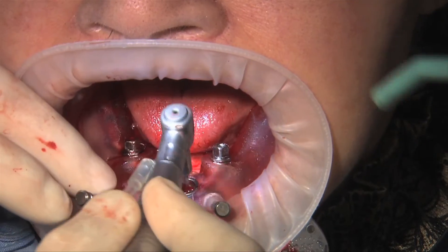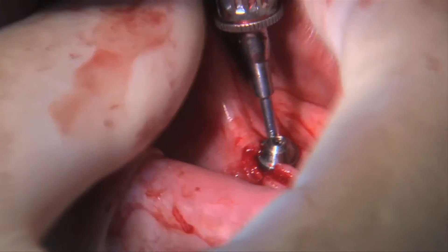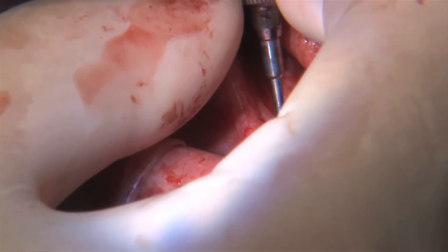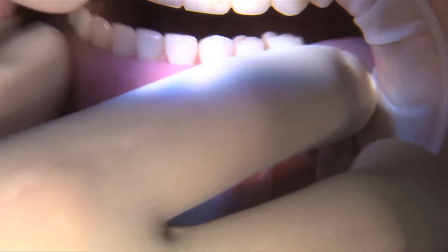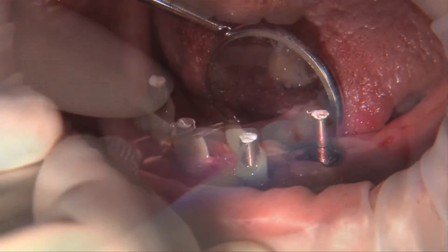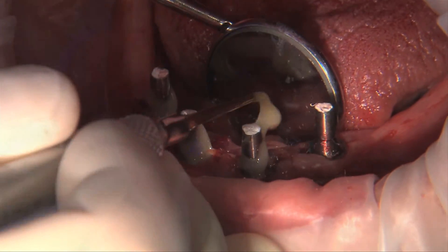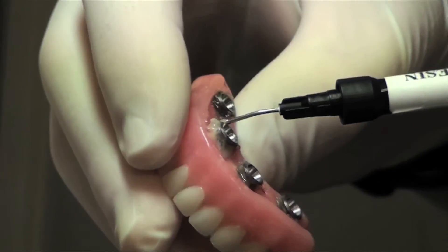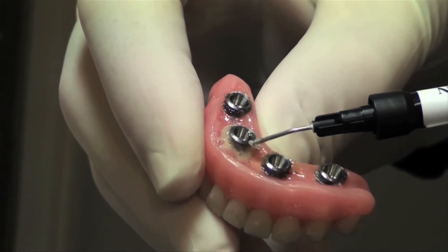Primary stability of all four implants was acceptable and the multi-unit abutments were mounted on top of the implants. The temporary prosthesis was held in place with the luting index and cold-cure acrylic was used to fix the prosthesis to the multi-unit temporary cylinders. After curing, the prosthesis was removed and finished extraorally before attaching it to the multi-unit abutments.